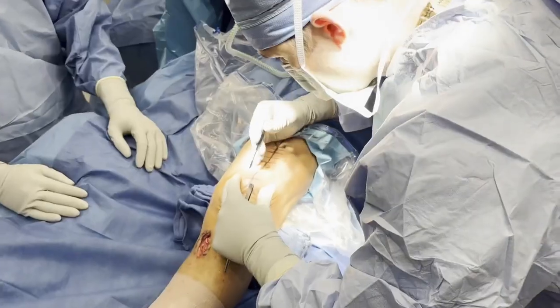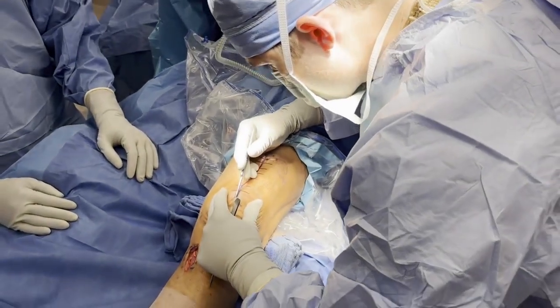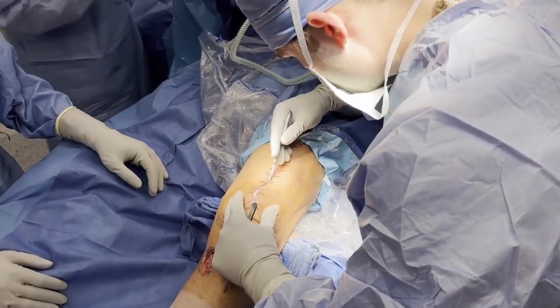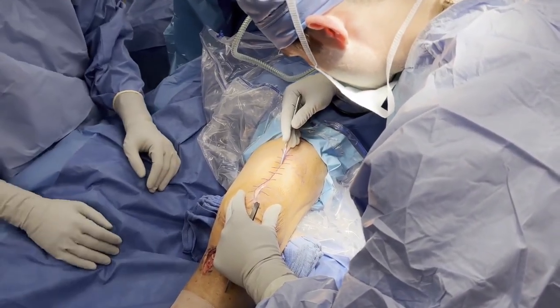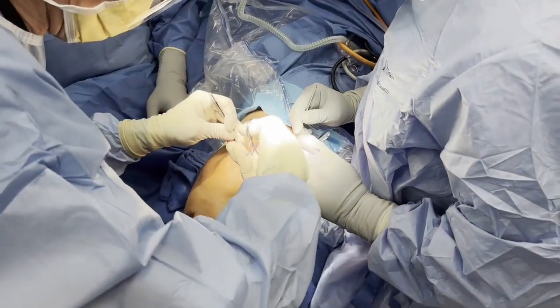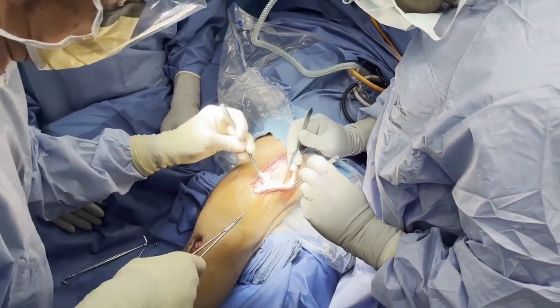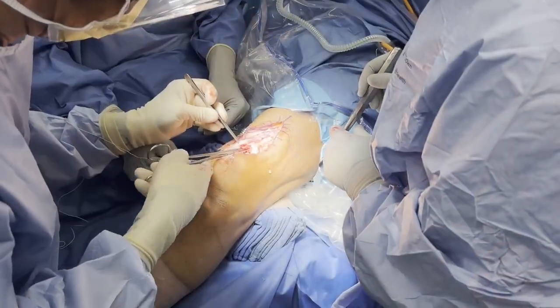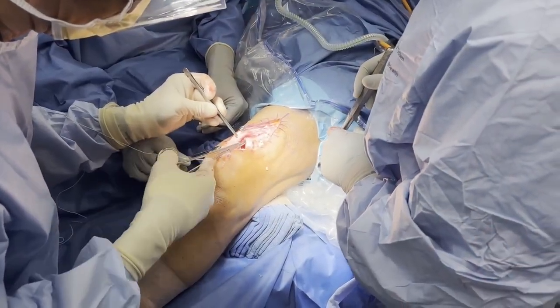Another incision is then made starting at the superior pole of the patella and carried approximately 8 centimeters proximal, utilizing the incision from the primary quadriceps tendon repair. Dissection down to the quadriceps tendon reveals retraction of the remnant tendon. A cobb elevator is used to mobilize and identify the tendon. The medial and lateral aspects of the quadriceps tendon are then tagged.